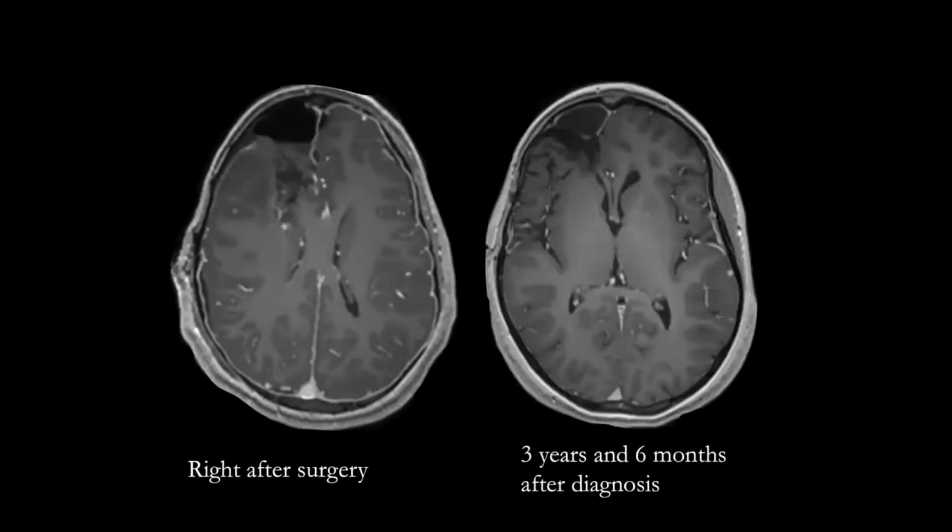And we can see that right after surgery, but also 3 years and 6 months after diagnosis, we have a patient without tumor recurrence and with just a small post-treatment lesion here, thanks to the gross total resection of the tumor.